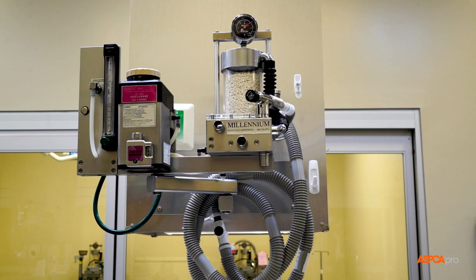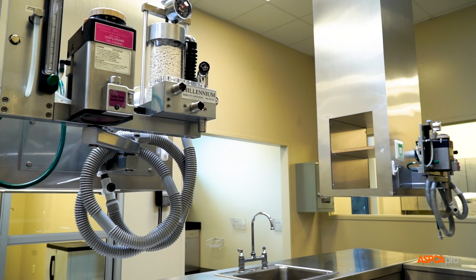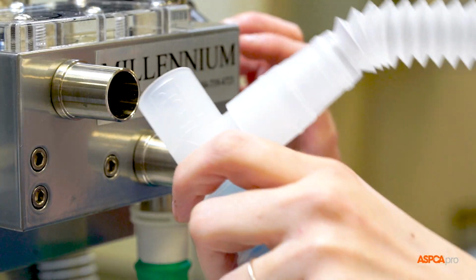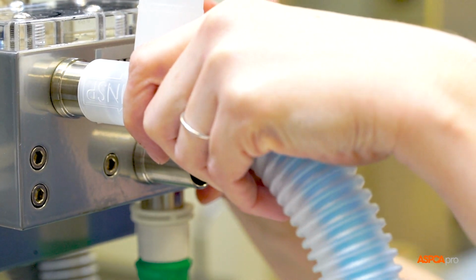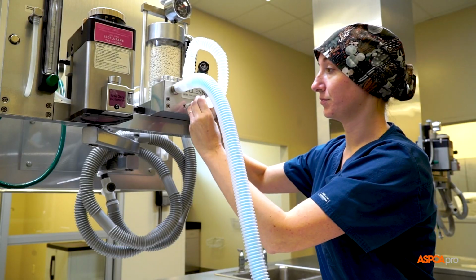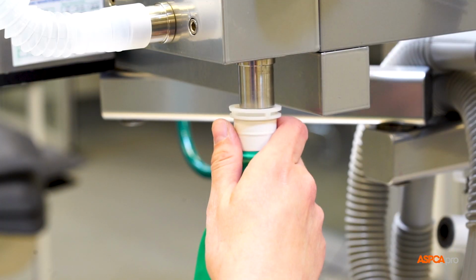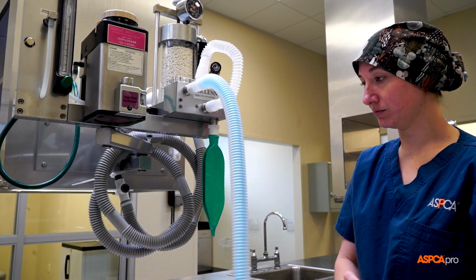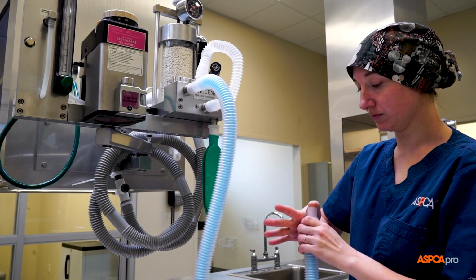Before inducing anesthesia, it is important to perform a low-pressure leak test to detect any possible faults within the system. This ensures both patient and staff safety. To perform the test, first connect the appropriate rebreathing circuit and reservoir bag for your patient's weight. Then block the patient end of the breathing circuit with your thumb or palm.